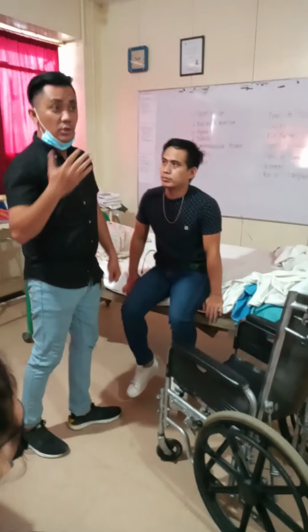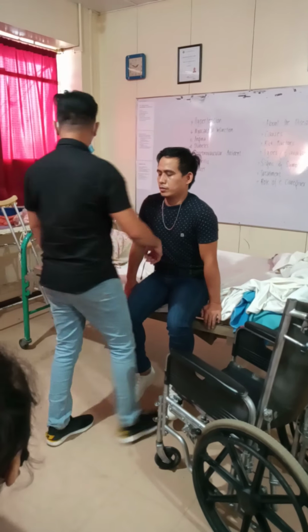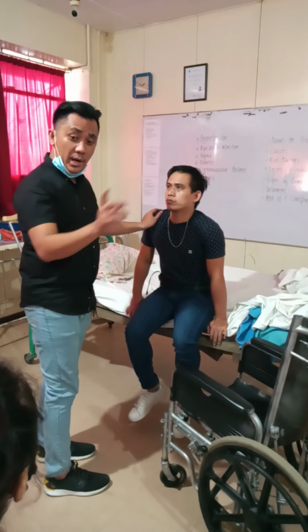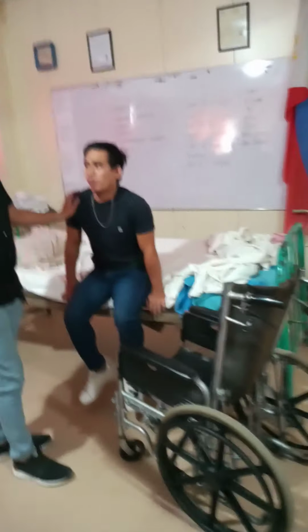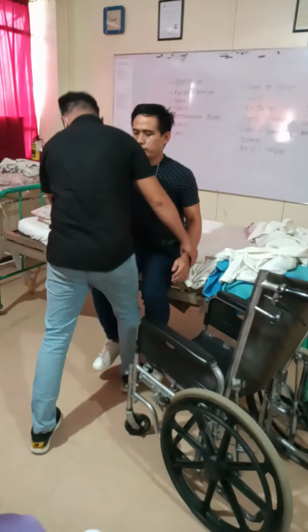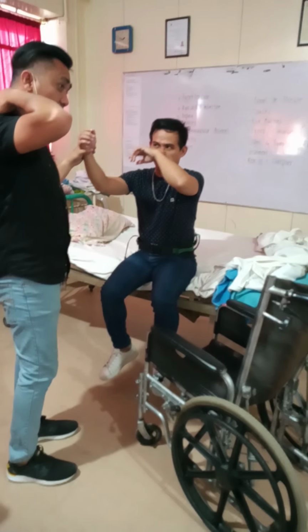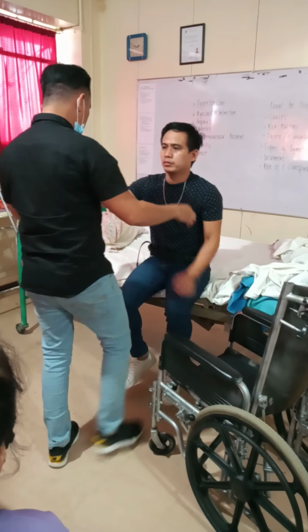Now, if you are a new caregiver or bago pa rin si patient sa inyo I would highly recommend na in between sa iyang legs. Kaya nga naman, wa pa makakibawon sa weight ani niya. Okay? Naiuban patient na gamay pero ining ansa ni mo, uy, bukat man ni gini siya. Bukat kay sala ning tuman sa siya. Okay? So, okay? Alright, so si patient is gunit na diri sa inyong shoulders. Ayaw sa inyo ha, liog. Kaya nga naman, kung ari diri sa inyong liog, basin mabalik. Ang inyong neck will never know. Okay? Mangusog yan na si patient yung baro.